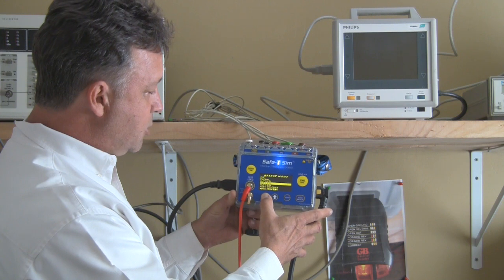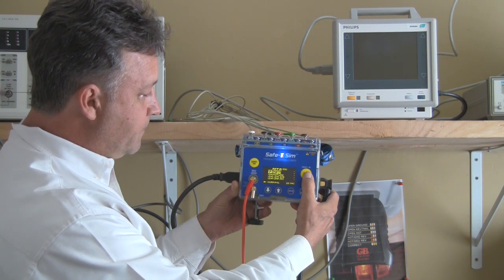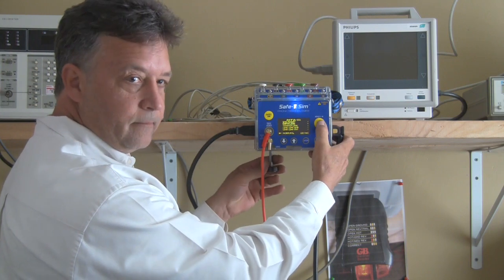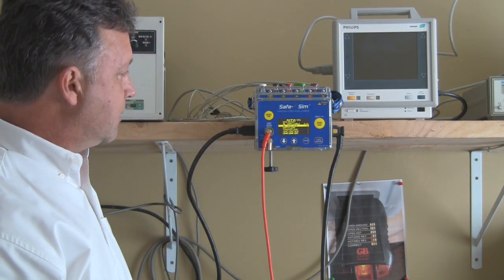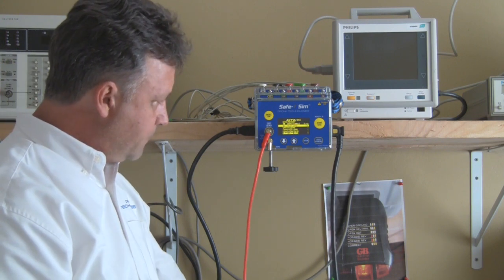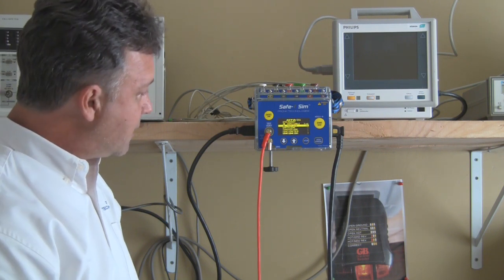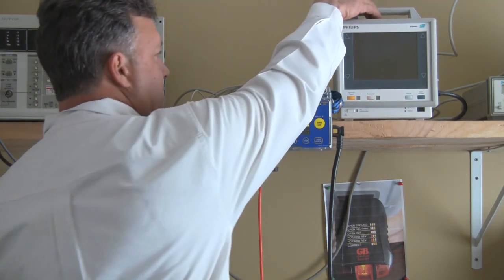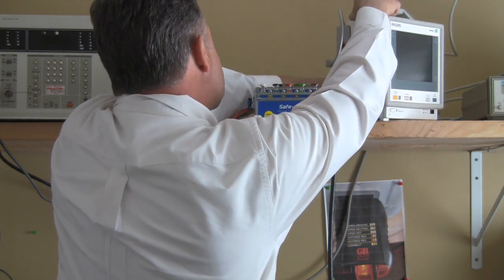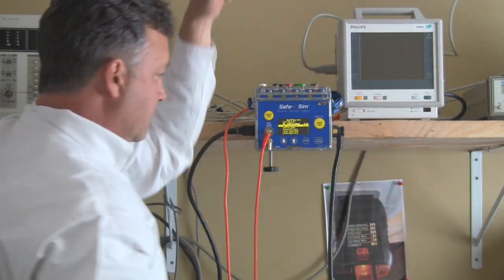I'm going to select the ES2 electrical safety test and show you a couple unique features with the device. If I hit enter I get the home screen for that auto test. From there I hit start. It's running a ground test — notice there's a flashing LED and an audible tone. The audible tone tells you that it is not yet seeing a passing value for the ground test, and the red LED tells you the same thing.